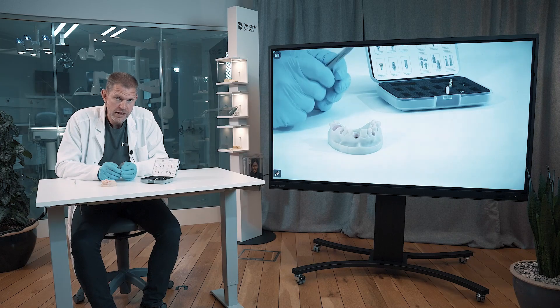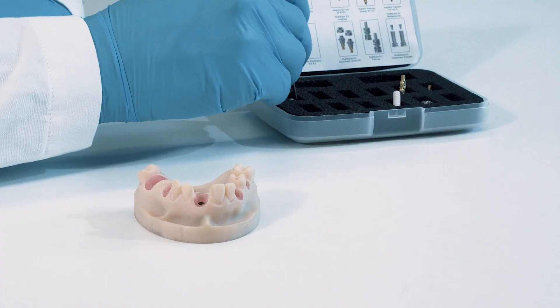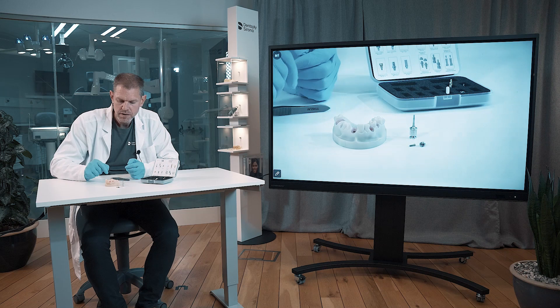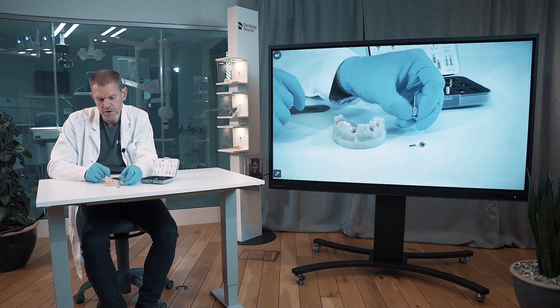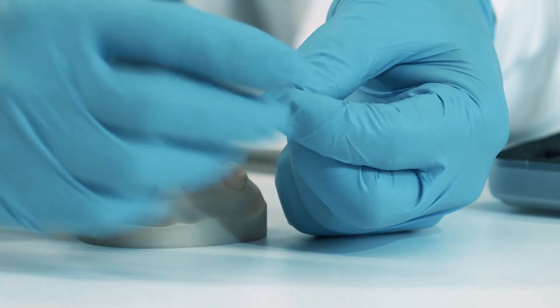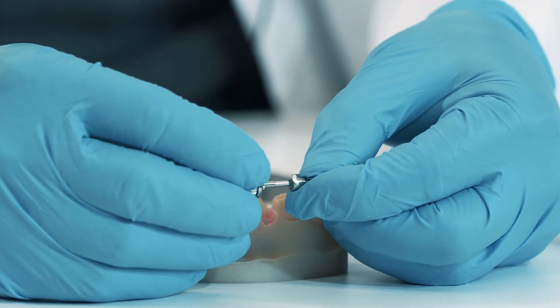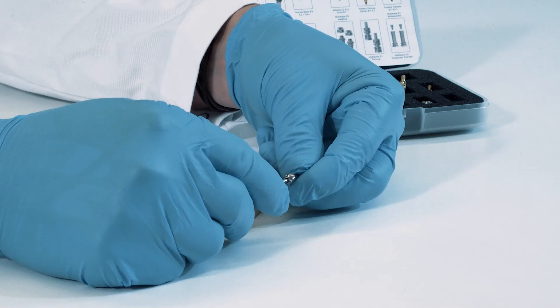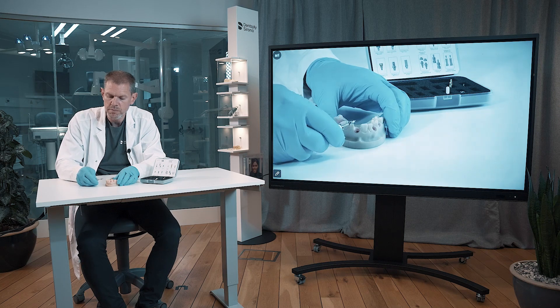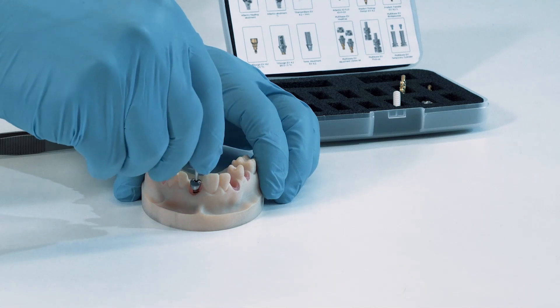The first healing abutment I want to show you is the Atlantis healing abutment. It comes with a separate screw. The easiest thing to do is to bring down the screw into the abutment body, putting the screwdriver into the hole or into the body of the abutment. You can see that it looks very customized, meaning it's patient-specific and fits only into one possible position.